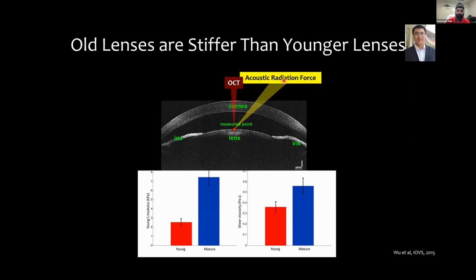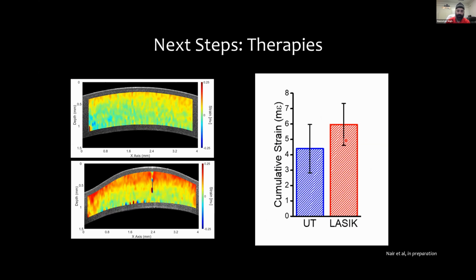Beyond that, one of the limitations is that we can't access the lens easily, so we have to use focused acoustic radiation force. And cataract.